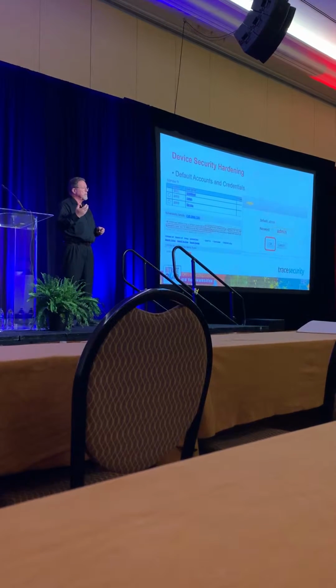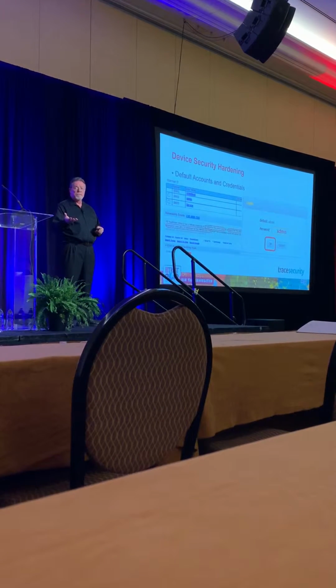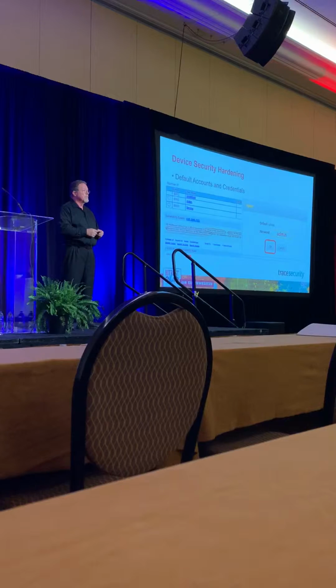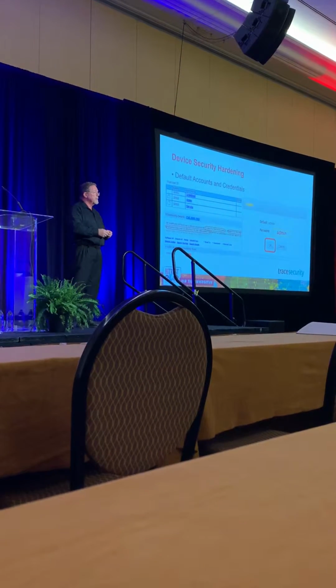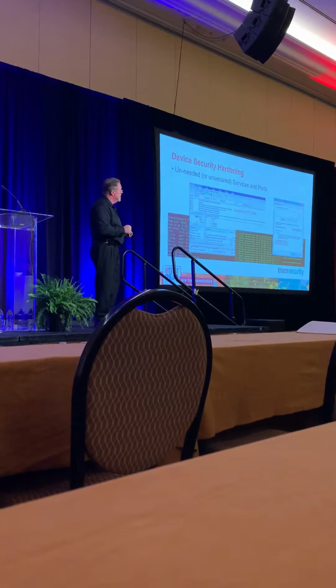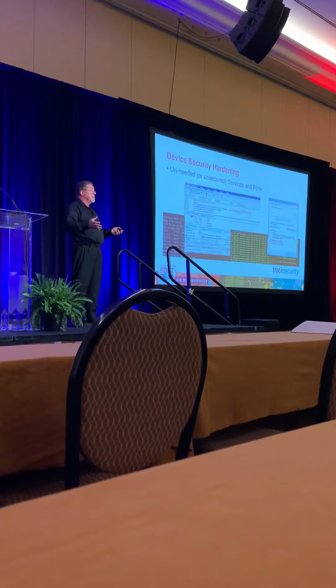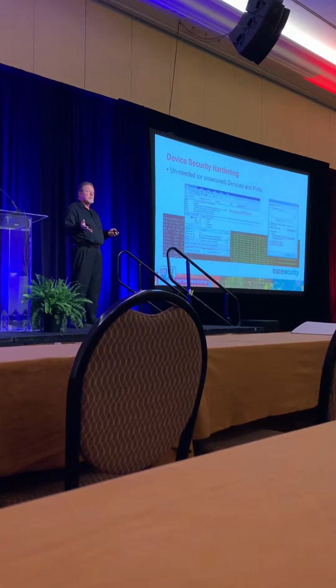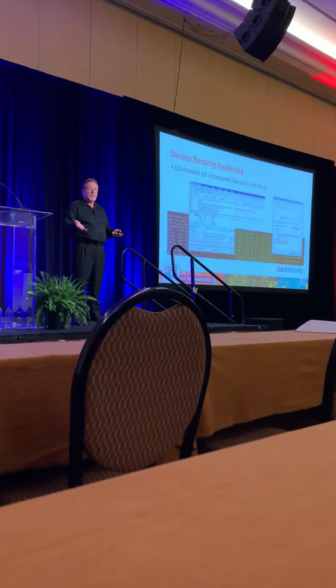So as an adversary, I don't even have to work very hard. I can go in, do a quick search of the network for management interfaces, find the default passwords, and log right in. So part of the system hardening is ensuring these things are changed. It's also ensuring that the ports and services on the device that may or may not be necessary for daily operations are disabled if they're not needed.